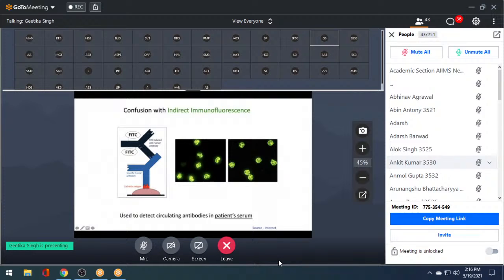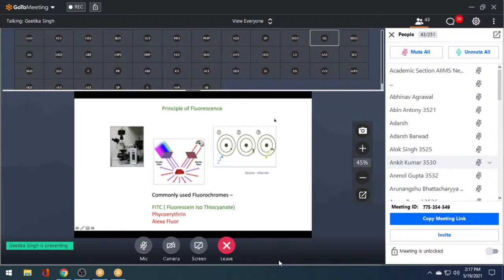And then I'm doing the same thing. I have an anti-human antibody, which is FITC labeled. Okay. So it's kind of a bit of a sandwich because this is what you want to detect. You will stick it down on a slide with an antigen of interest here. And then you will use an anti-human antibody, which is FITC labeled. Okay. So it's absolutely different. And what are we doing in the kidney? We're doing a direct immunofluorescence.